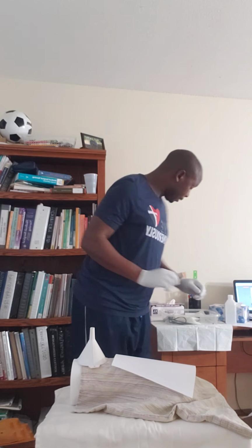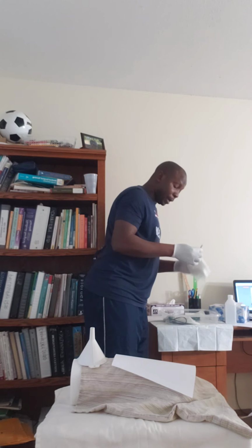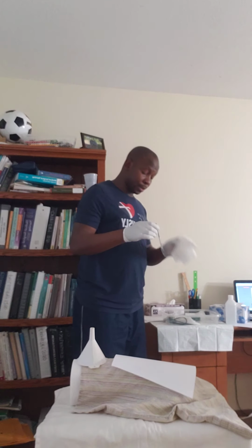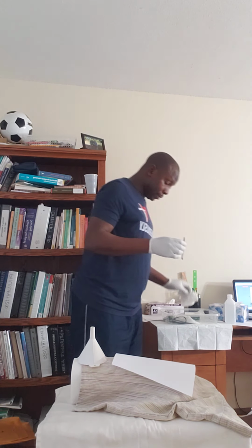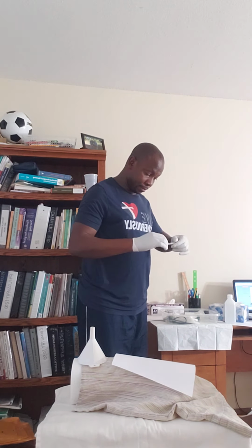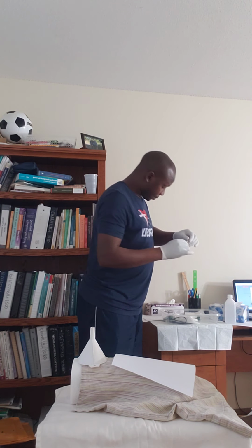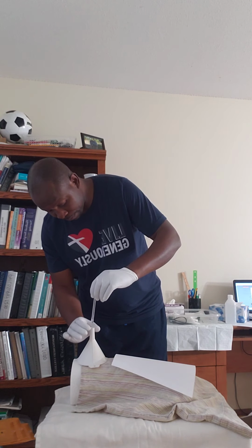Now I'm going to clean again, and dry with the gauze, to dry the cannula. Then the cannula. Press my cannula.